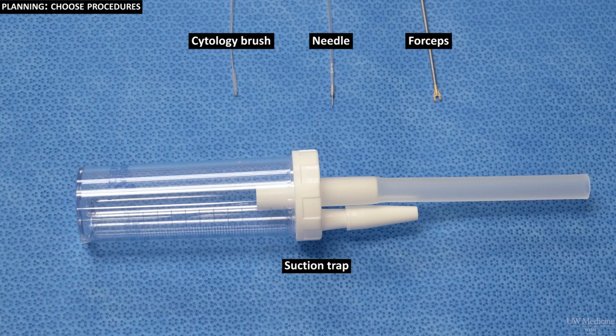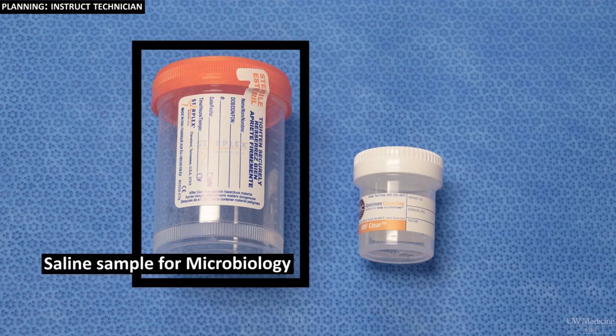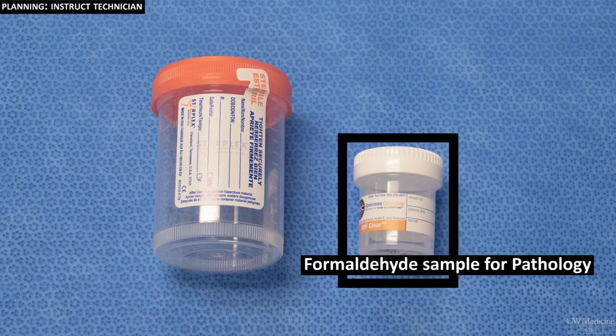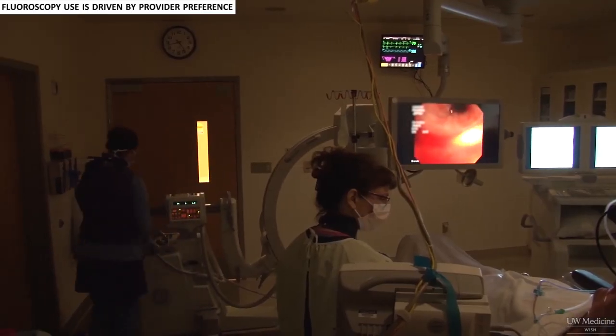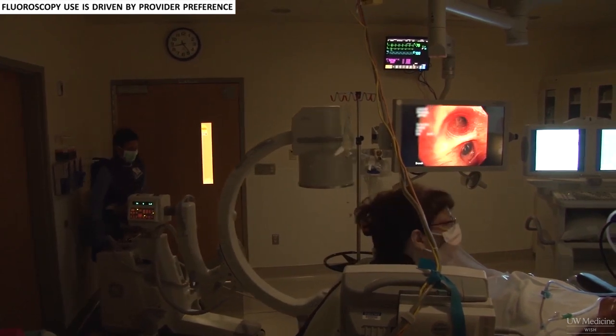Before you start the bronchoscopy, you should decide which procedures are necessary and the order you will do them. You should also tell your technician if you want any samples to be placed in saline to be sent to the micro lab for culture. Once samples have been placed in formaldehyde solution to be sent to pathology, they cannot be used to culture organisms. You can have all your samples placed in saline and then transfer some into formaldehyde solution at the end of the procedure. In this module, I use fluoroscopy images to illustrate techniques, but you don't have to use fluoroscopy.